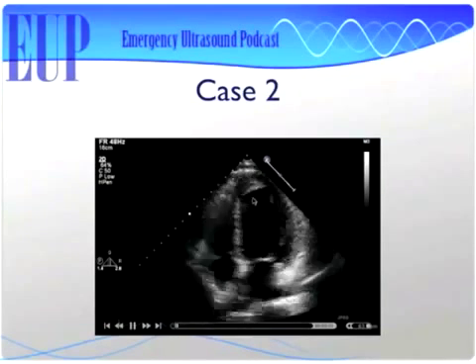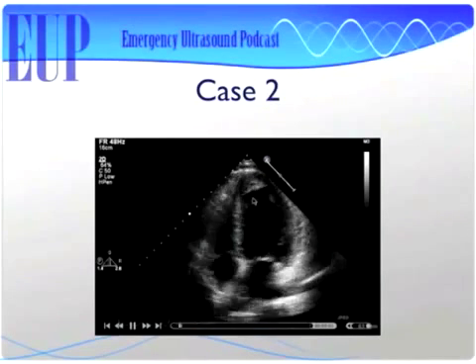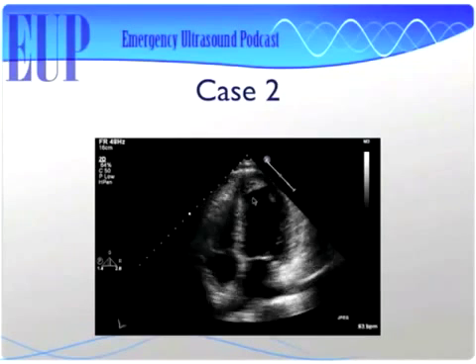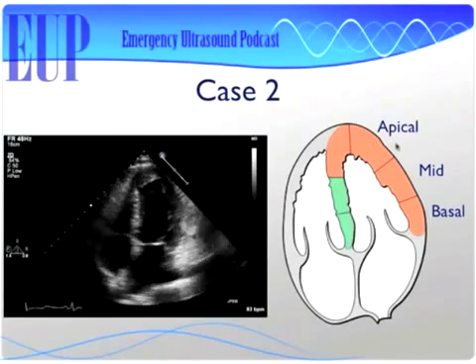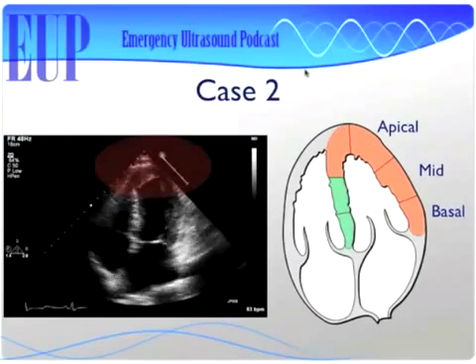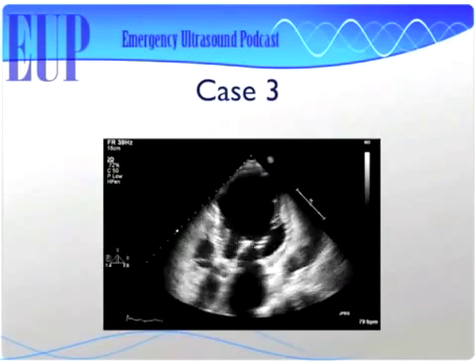I think I just saw a little part shoot right off into the carotid. Yeah, they just stripped right there on that echo. Wow, it's terrible. All right, so interesting finding, not necessarily something you want to see in one of your patients. And here we're just showing the apex all the way to the top here, which is typically LAD distribution. Voila.